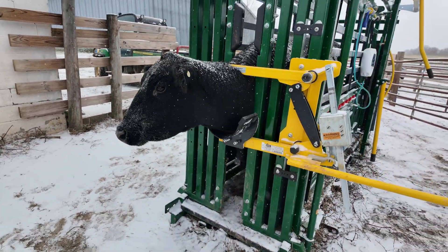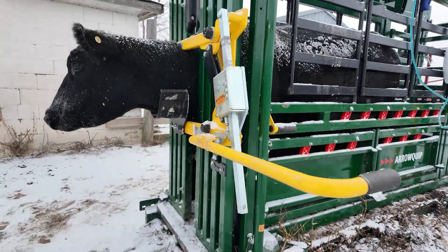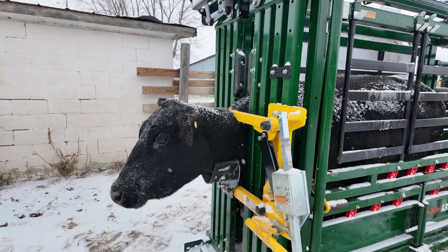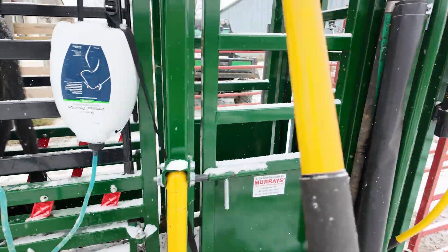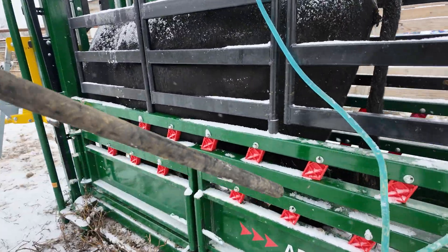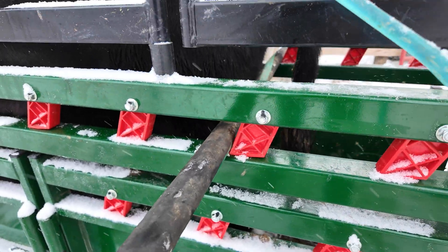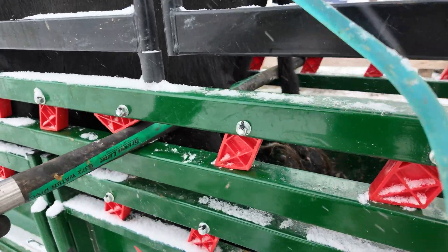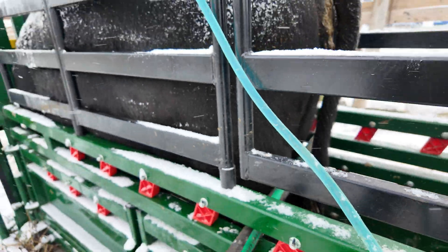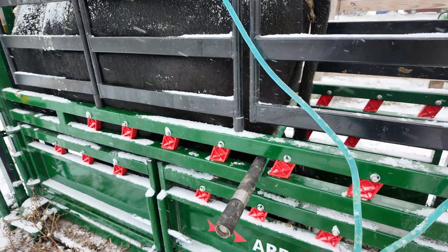Once you get them locked in the chute, make sure their head is locked in the head catch. I put the head holder down to try to hold them a little more still — the less they move around while you're doing this, the better. We've got a bar that we're going to put in behind their legs, and slide it in there just like that. The sole purpose of this is to pretty much keep them from kicking back at me, which is a huge possibility. That prevents them from really moving around anymore.